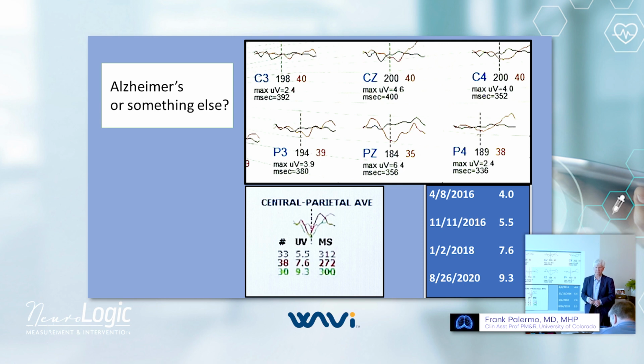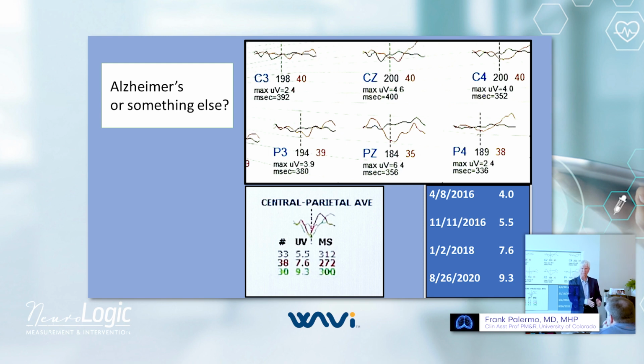And you can't get this. I don't know how else you get it. You give them a neuropsych test. How many of you ask for neuropsych tests? Good answer. Because I try to. I've got 3 or 4 patients right now I want to get neuropsych tests, just to prove to the patient that they're having issues.